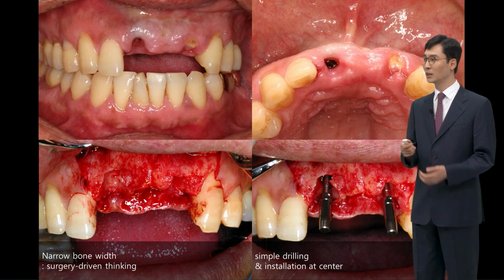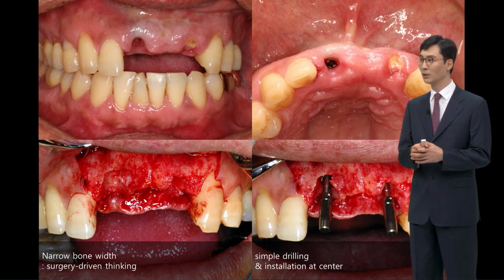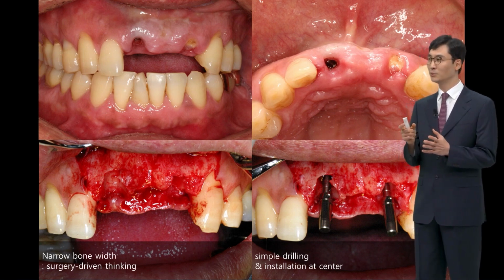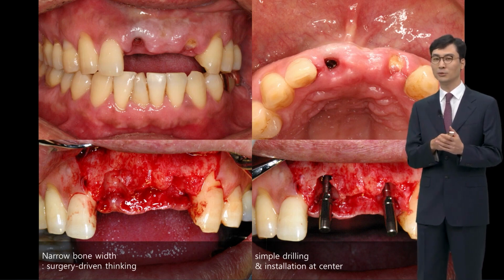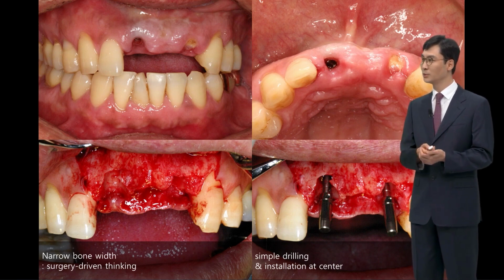After extraction, the buccolingual width of the bone was very limited. I was not able to consider the final prosthesis much. I just placed the implant where the bone was. I just tried to place it in the middle. Drilling was done and implant was placed.